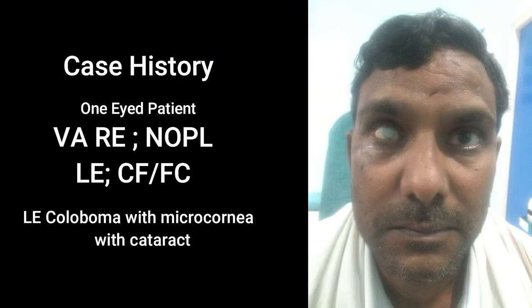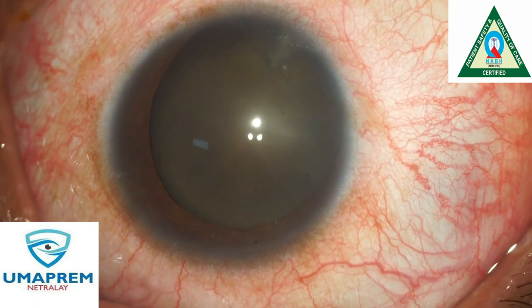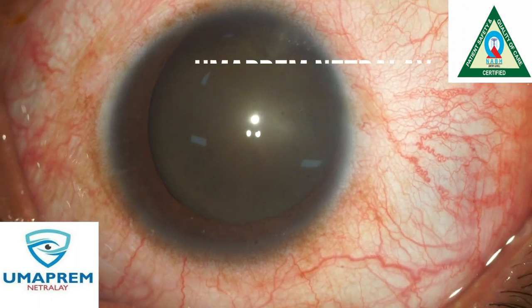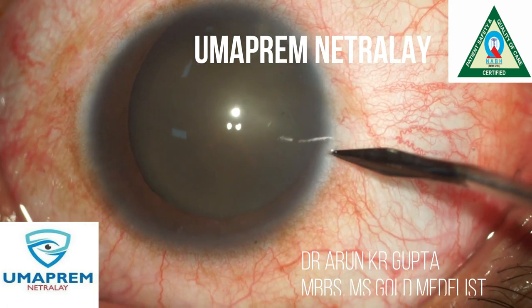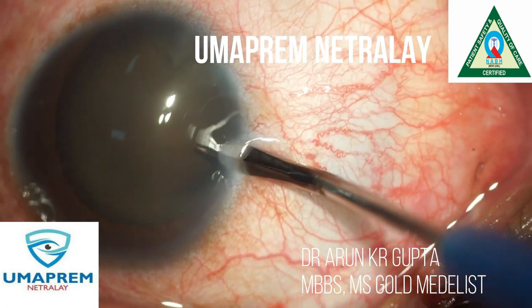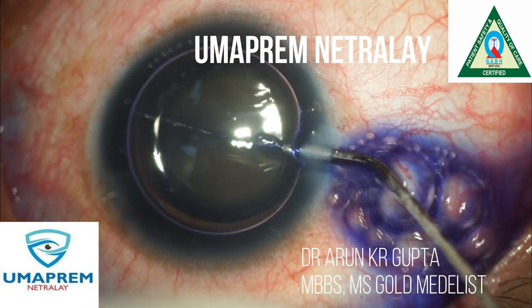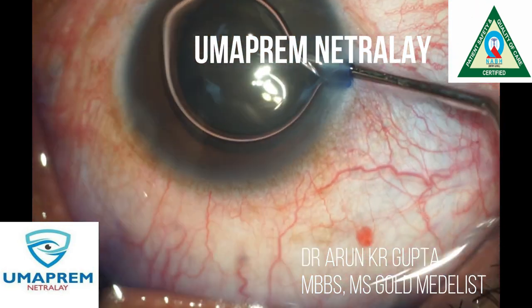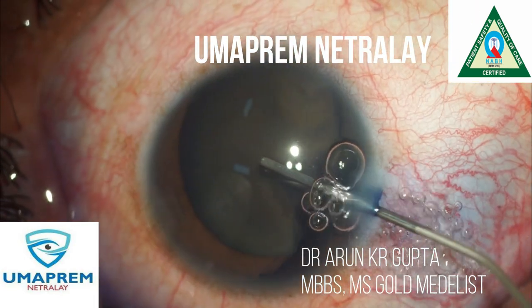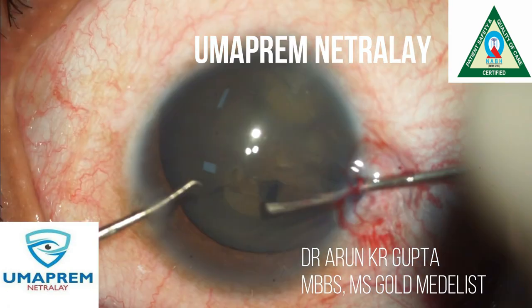Hello everyone. This is a one-eyed patient having phthisis in one eye, and the other eye is a coloboma with a very hard brown nucleus. We perform a phacoemulsification procedure for this one-eyed patient using our Alcon Centurion machine. We start with capsulorhexis after staining of the anterior capsule.